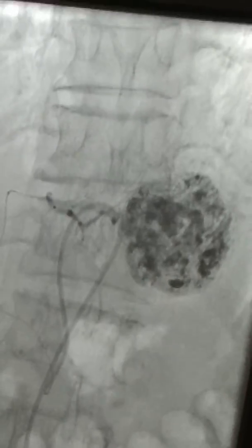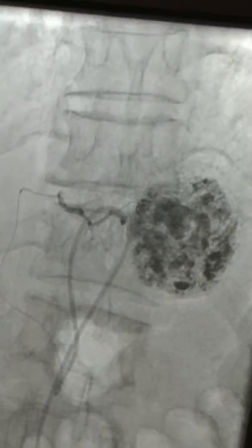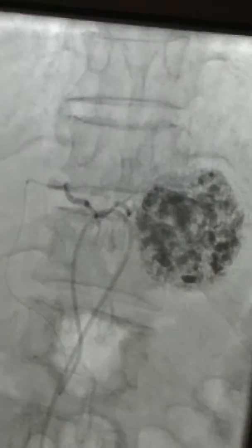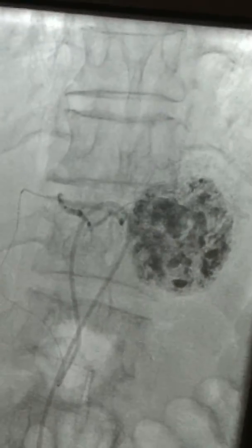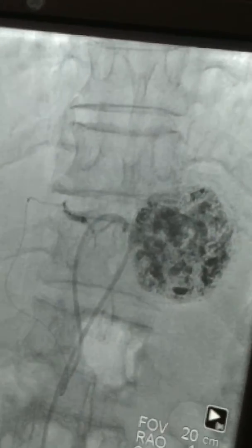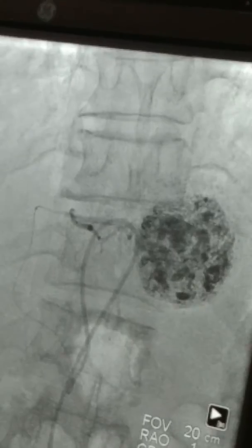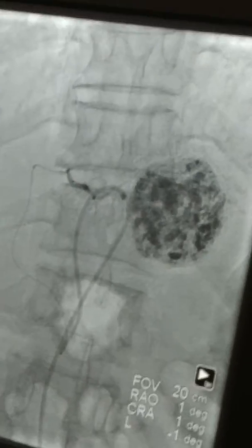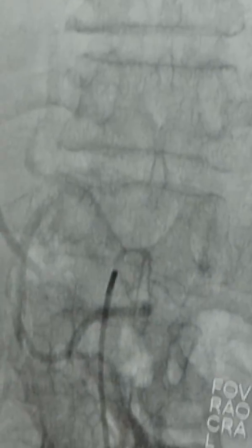We discussed with Dr. Mali, and she has late Child B liver status. We are into the left hepatic artery branch and have selectively chemoembolized it. The lesion looks very good, and this is the base angiogram.